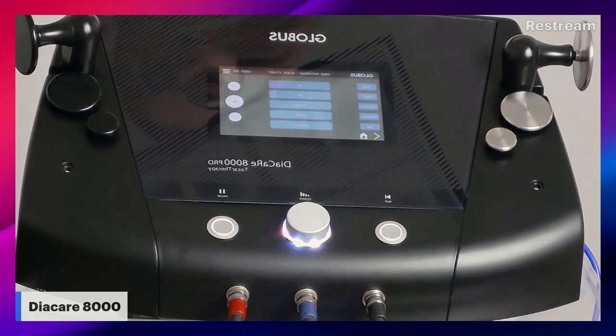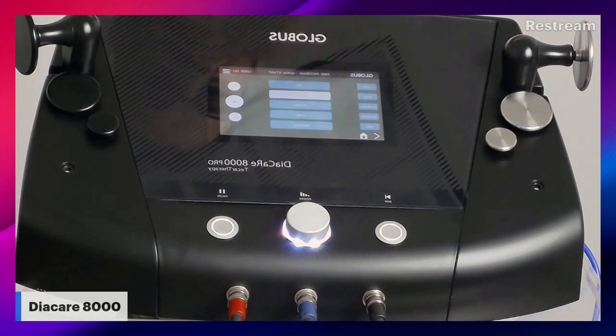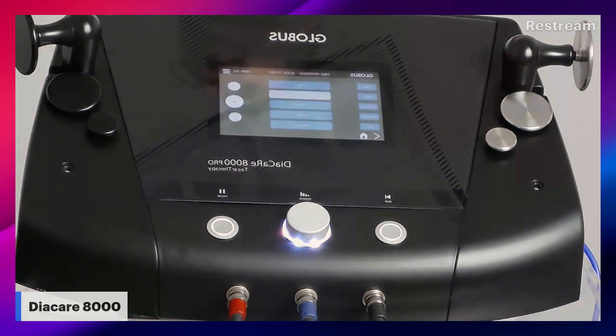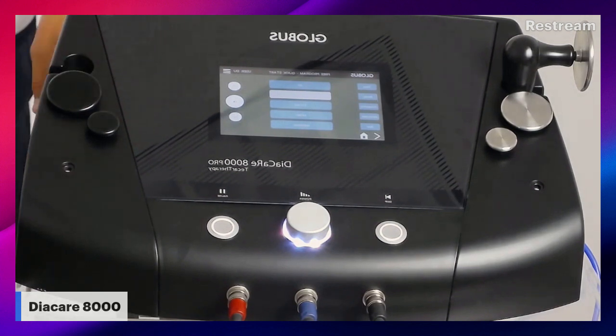Things to consider now. What size of the head are we going to choose? We're using the low back, so we can use a bigger head to the active electrode here. And we want to start in a capacitive form because we're going to warm up that tissue, okay? So we're going to go for that superficial warmth. We're going to be moving it around local to the head of the electrode, and we're going to start moving through the structures like the muscles in his low back. Then I'm going to show you, we're going to go into more of the resistive as well, okay?